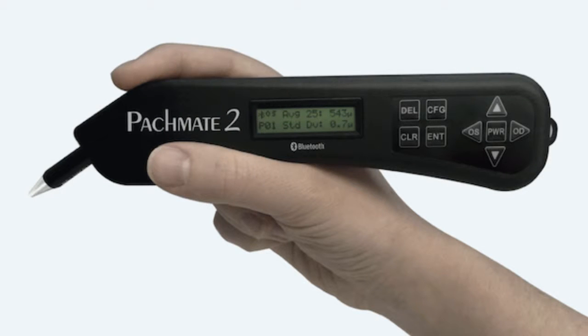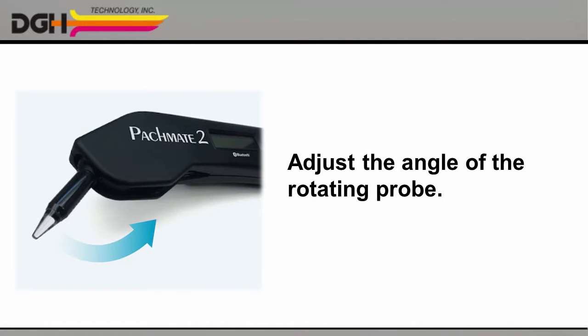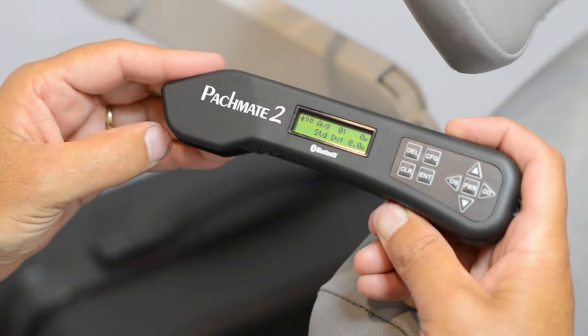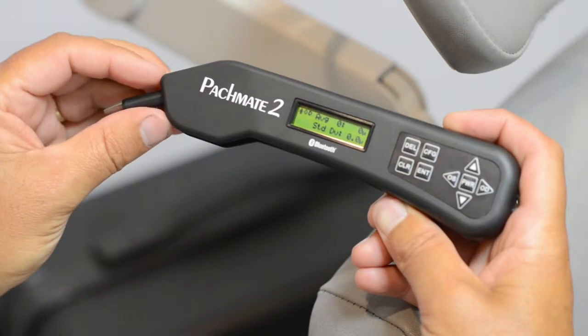Let's take a closer look. The Pachmate 2 includes an LCD screen where you can review your measurements, simple controls to help you adjust your settings and navigate your measurements, and the ultrasonic probe itself. You can easily adjust the angle of the probe to make the procedure more comfortable for you and for your patient. Rotate the probe into the body of the device for protection during storage and transport, and pull it back out again the next time you need it.